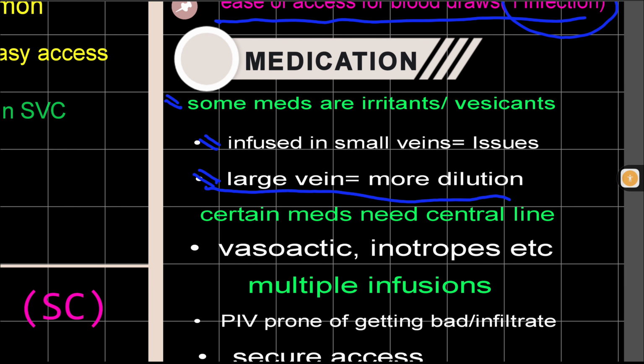You normally see them on fluid replacement therapy, where the doctor is ordering like 200 mLs per hour or 300 mLs per hour to keep that MAP level up, or to hydrate the patient, or sometimes a stat dose of 1 liter for 2 hours. A single peripheral cannula can only hold so much, because there's actually a limitation to it.